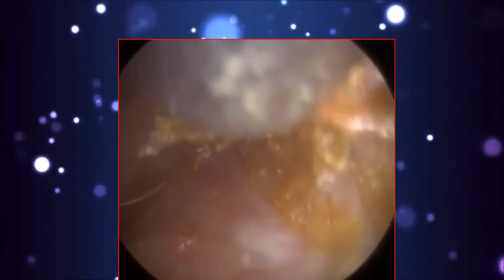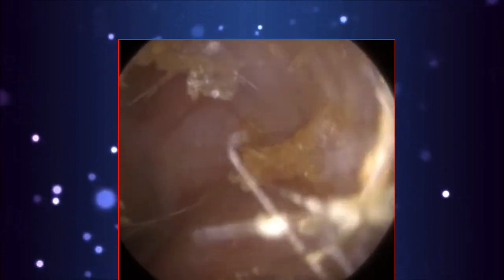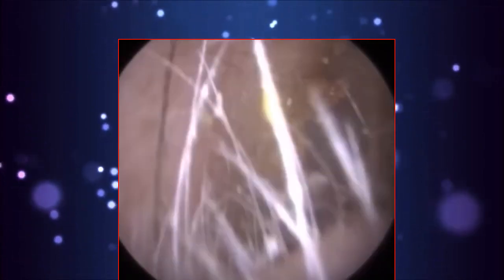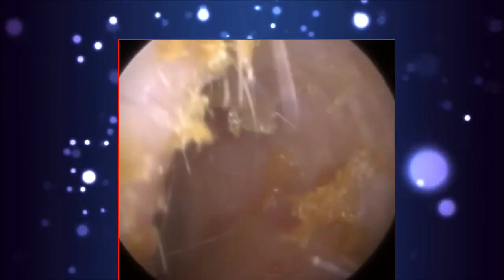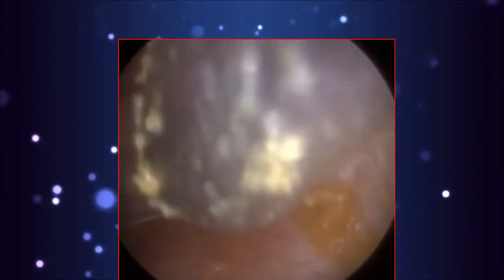So when I use the forceps, the bottom jaw, and actually the distal end, so the tip of the forceps is quite sharp. And as I was trying to get the bottom jaw underneath the loose hair, I made the mildest contact with the bony part of the ear canal. You'll see in a moment, I'll highlight it to you when it happens, which very slightly grazed the ear canal. And the patient did feel it. Now, it wasn't massively uncomfortable, but the patient did move. And looking back, I should have just left it, as it wasn't going to cause massive issues.